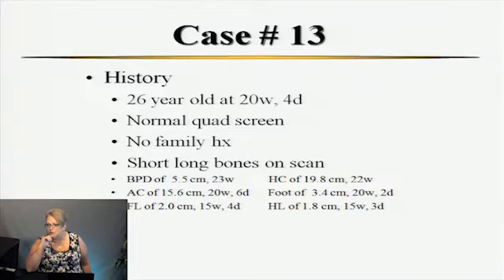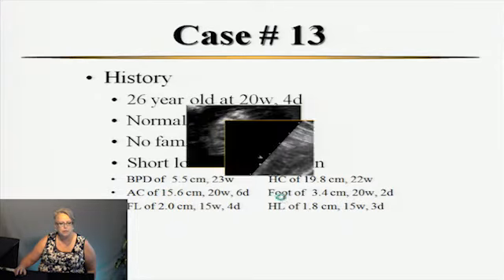That's one of the things, because a lot of times you're wondering, is the femur short or is the baby big? What's going on? Is this truly a short femur? This is one of the things you can do: look at the femur-foot ratio. Look, the foot is measuring 20 weeks, 2 days. So when we look at this femur-foot ratio, it's abnormal.